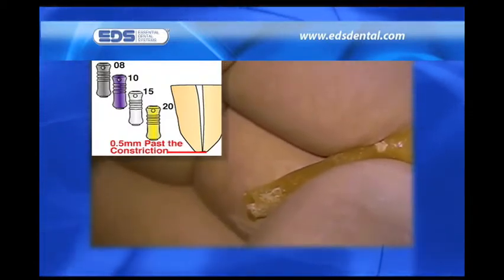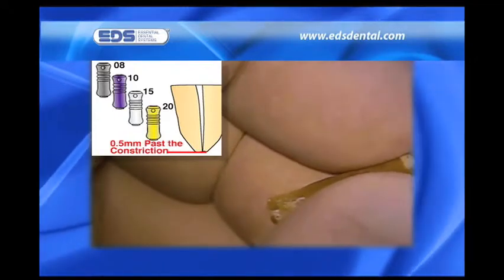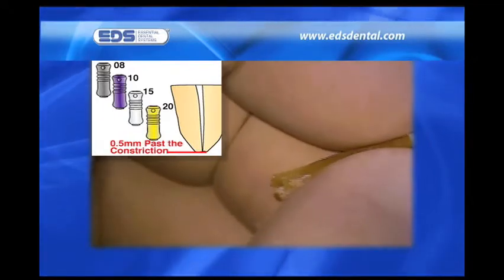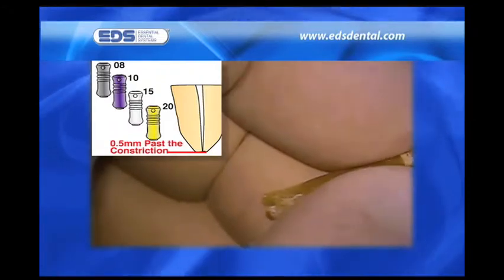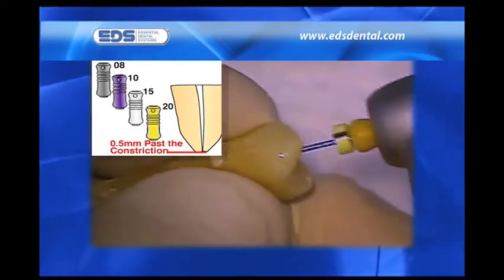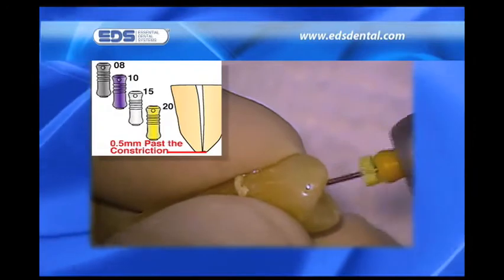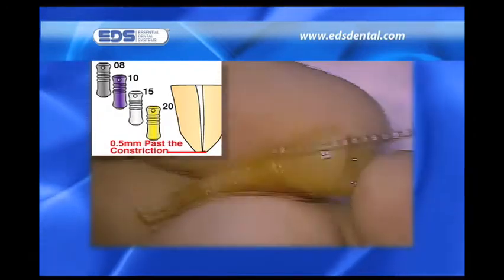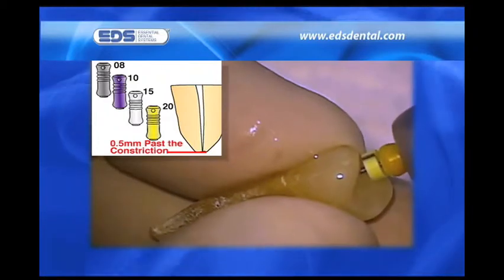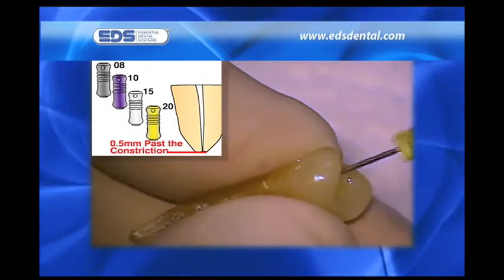Once the length has been established, we place a rubber stop on the number 10 reamer at the appropriate length and attach it to the reciprocating handpiece for rapid instrumentation to 0.5 millimeters beyond the constriction. We place the rubber stops at the same 0.5 millimeter extension on the numbers 15 and 20 SafeSiders. Please note how easily they negotiate the length.